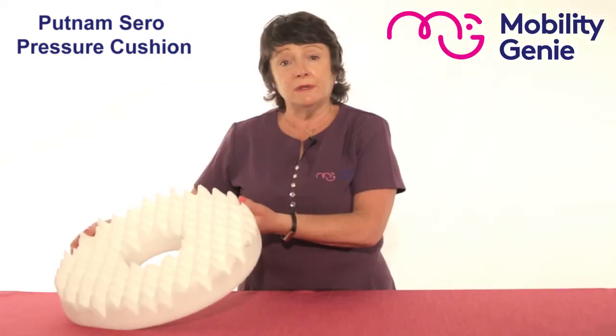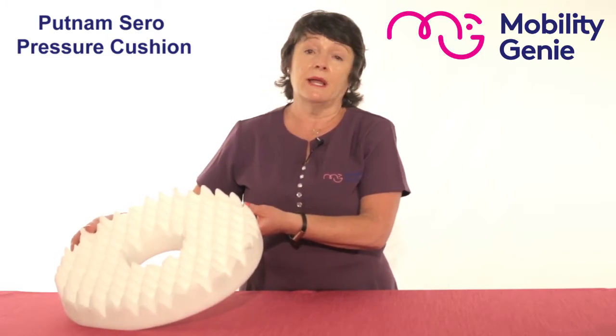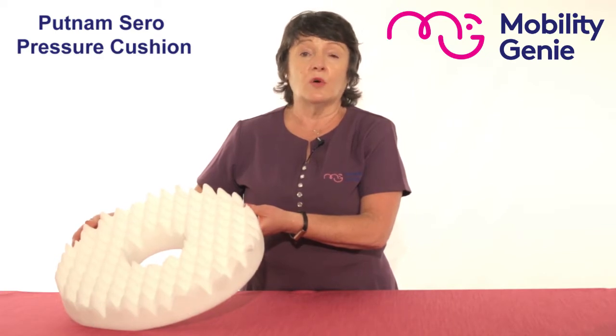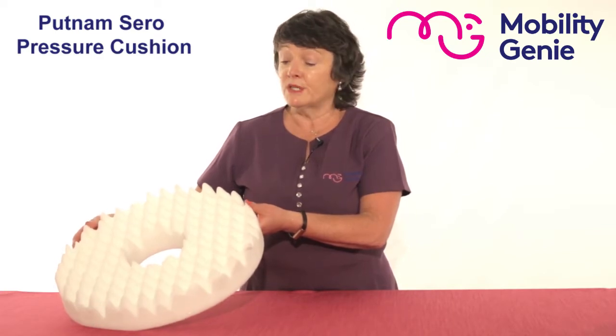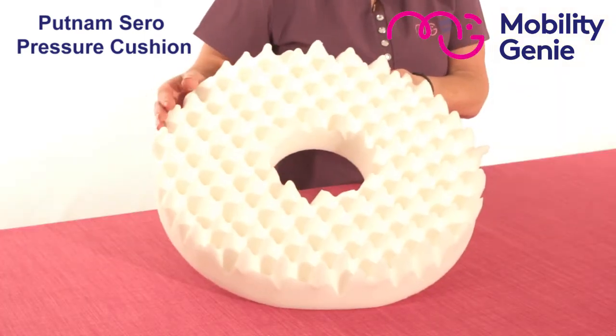It's suitable for people who have a problem in the middle part of their bum — perhaps they have hemorrhoids or a prolapse. When a person is sitting, that sensitive area sits over the hole, and that gives pressure relief.